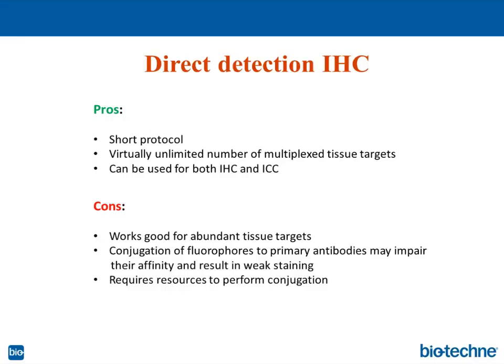There are cons to this protocol. It works well for abundant tissue targets, because you don't have a large number of fluorescent dyes detecting the antigens of interest. And that's why the target should be abundantly expressed to be visualized.